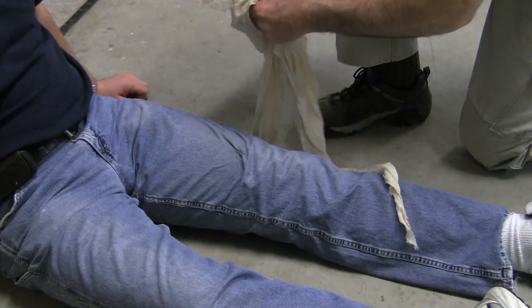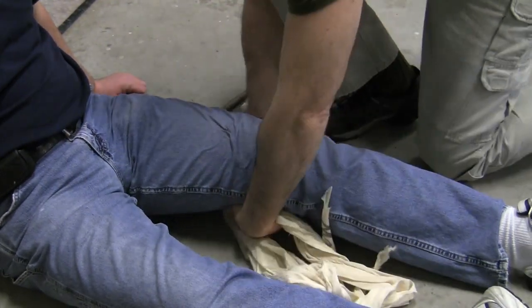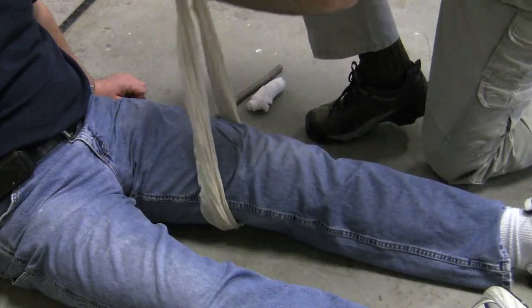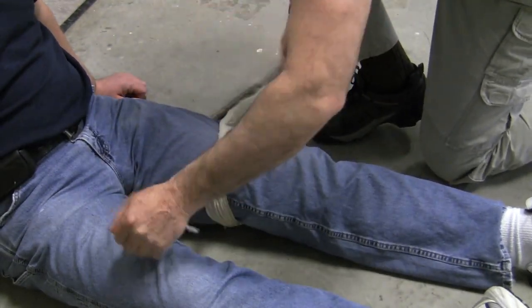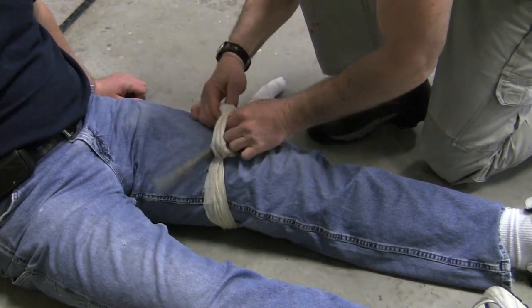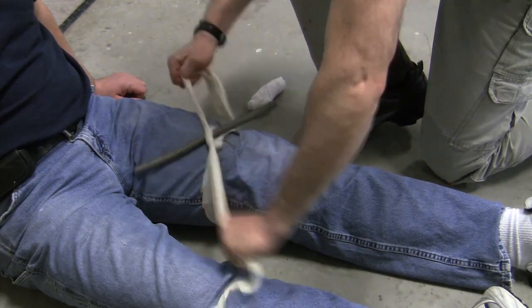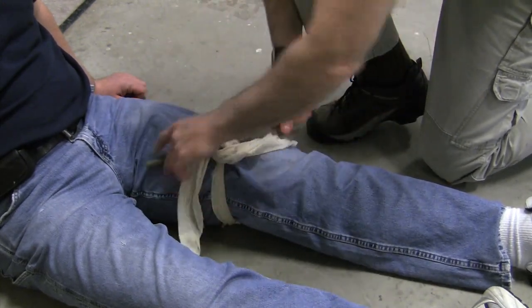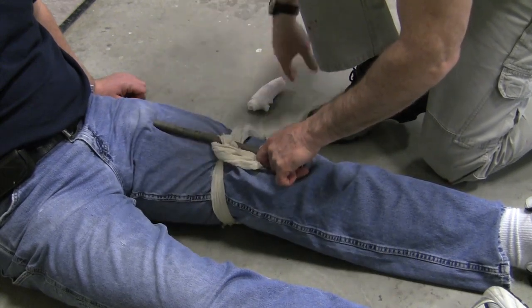In this demonstration of a field expedient tourniquet, we will use a triangular bandage or a cravat as our strap. Once we have located the source of bleeding, place the material 2 inches above the wound and then tie the knot as tight as you can. Next, we will place our windlass, in this case a stick, over the bandage, then take your cravat and tie another knot over the windlass. Then twist the windlass until bleeding has stopped.